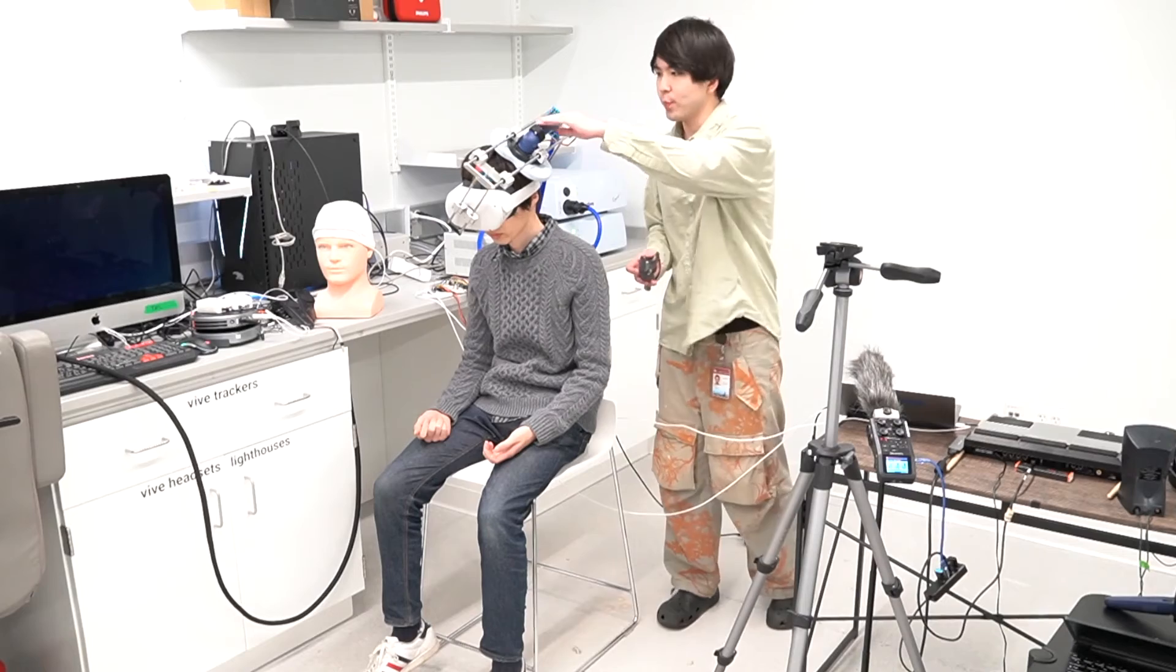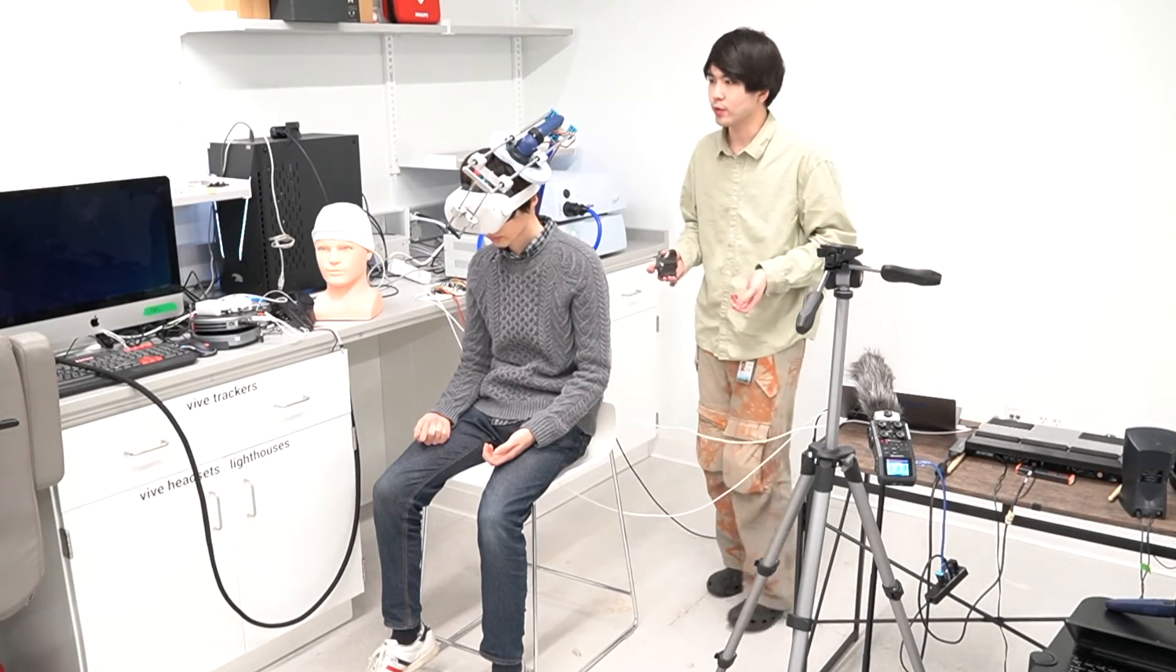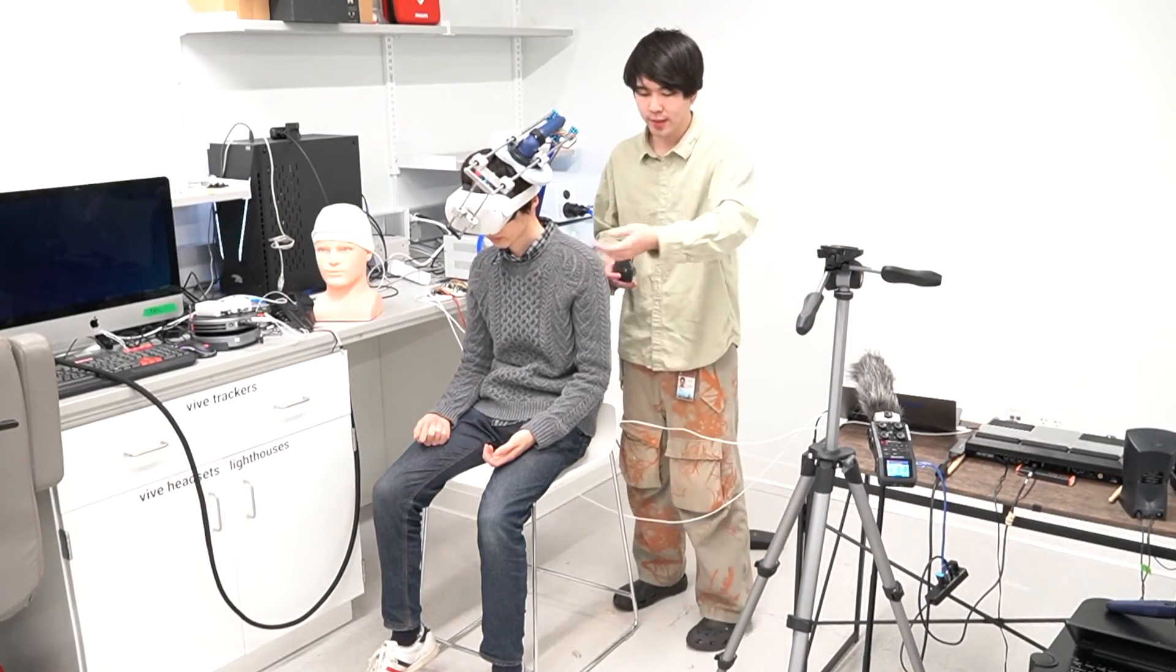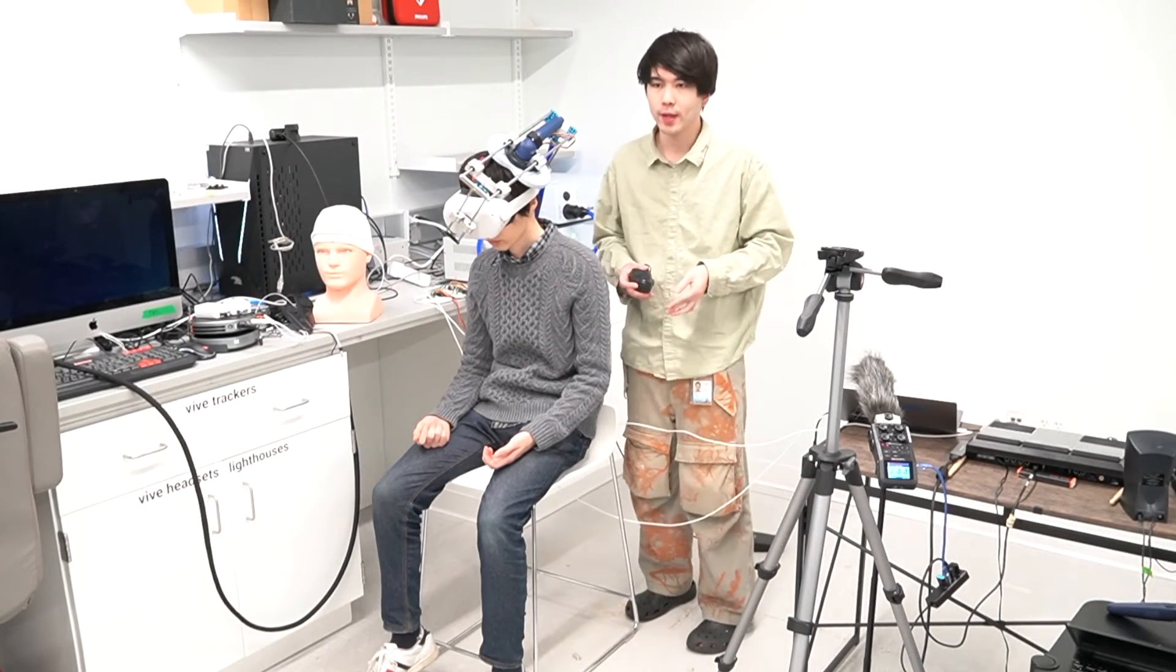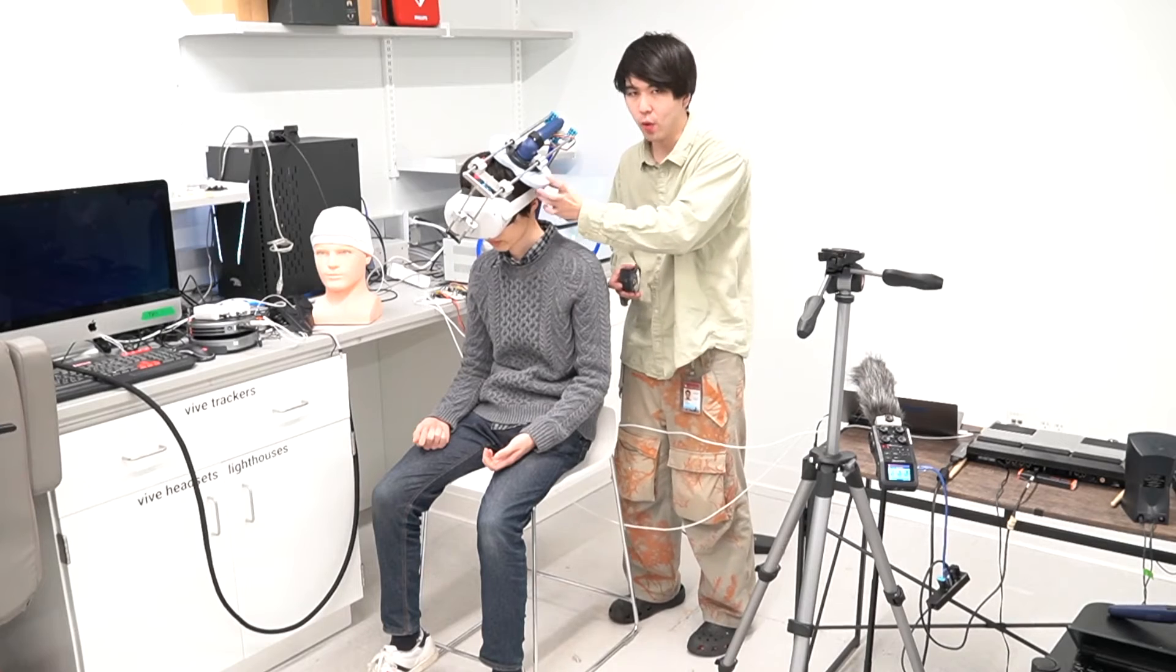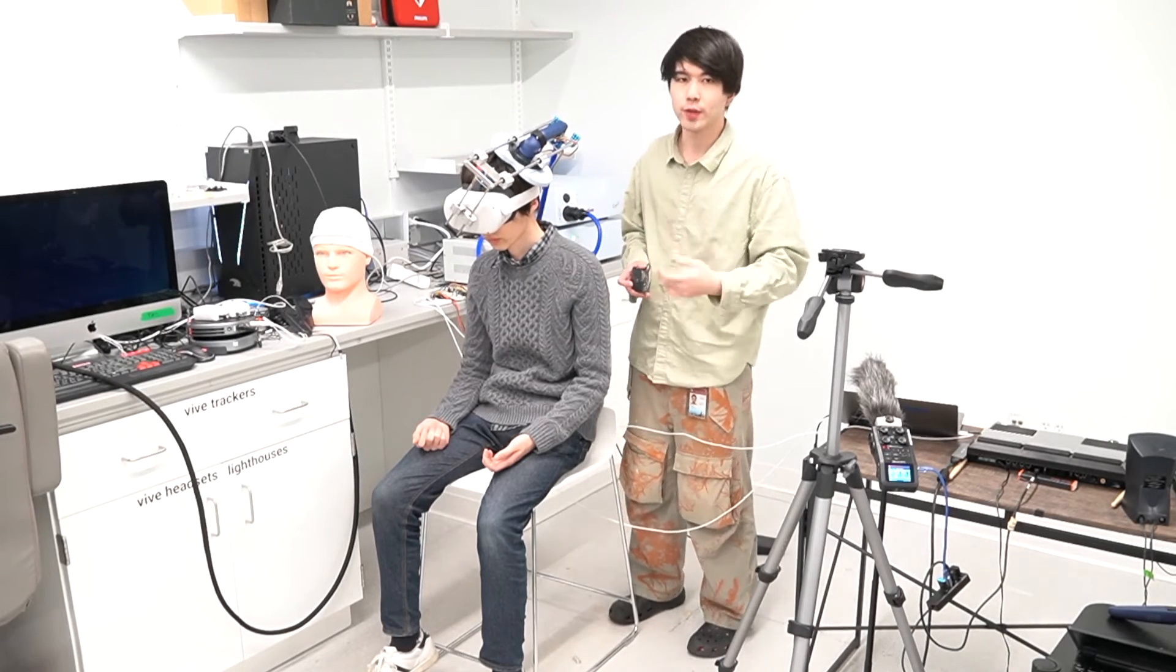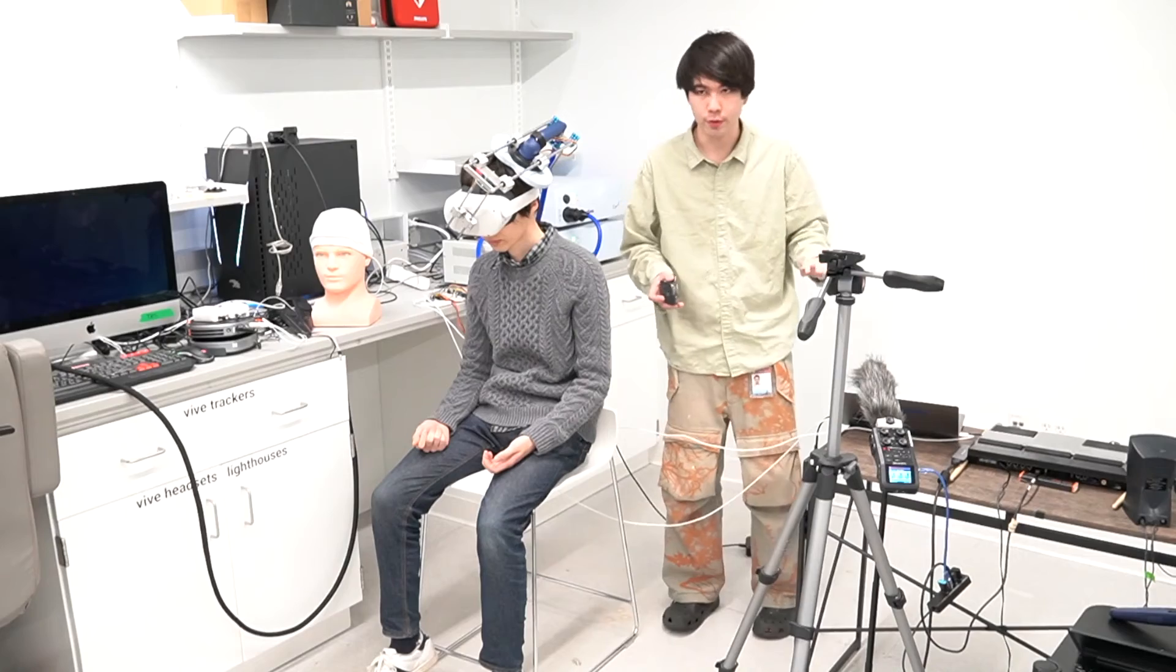By controlling this position of the coil robotically, we were able to create all these sensations across all the limbs. And this is based on that this section of our brain's cortex corresponds to the sensations from our entire body, sometimes we call homunculus.